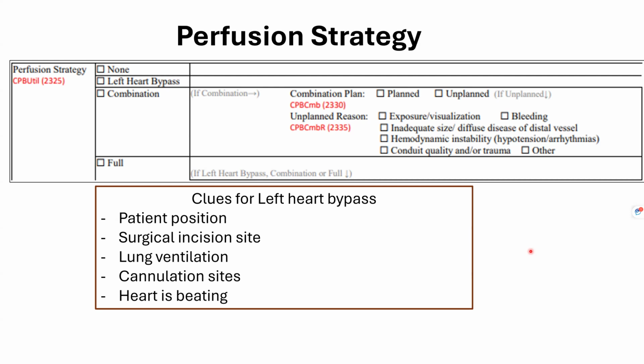Meetali, this is Judy. There's going to be some ischemic time from the clamps. In between those clamps, you're going to have some ischemic time to your intercostals or whatever, right? Unless you do that little special hookup thing, right? Yes, there's still an ischemic time.